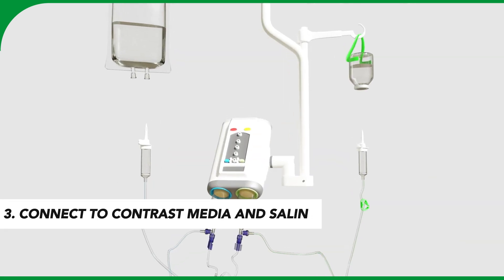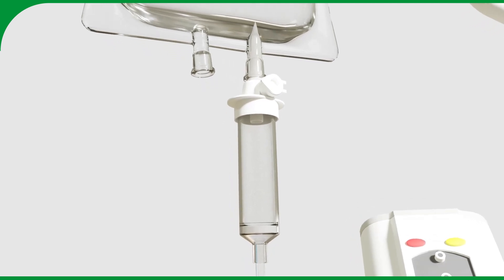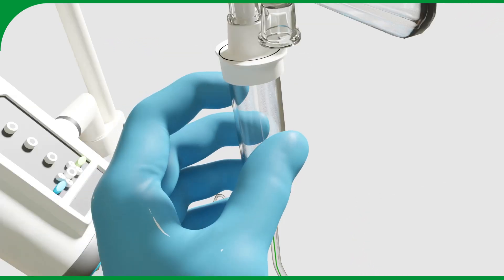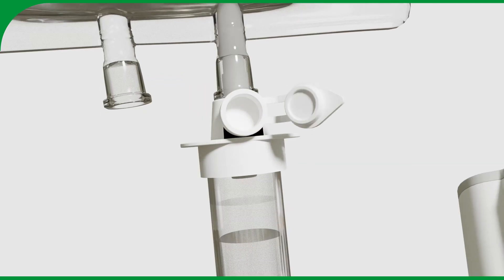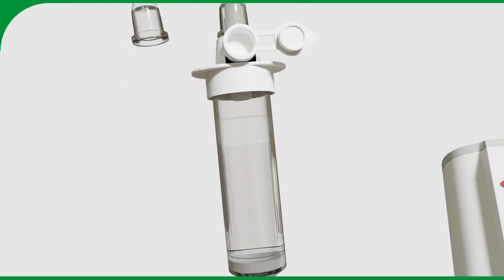On one side, connect the trans set to a saline reservoir. This line is marked with the blue color. Once the spike is inserted, open the air inlet and squeeze the drip chamber to start the inflow of saline.